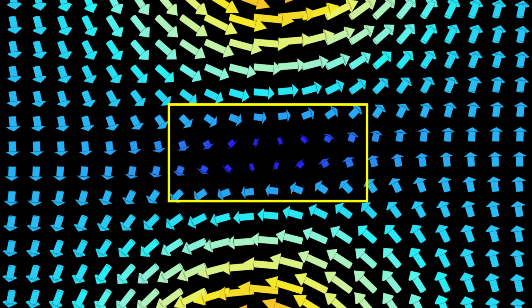The X gradient is exactly the same as the Y, by the way. Just copy, rotate 90 degrees, and paste. So that's a very introductory introduction to gradient design. Nowadays, gradient experts employ sophisticated field simulations, finite element analyses, and even AI in gradient coil design.